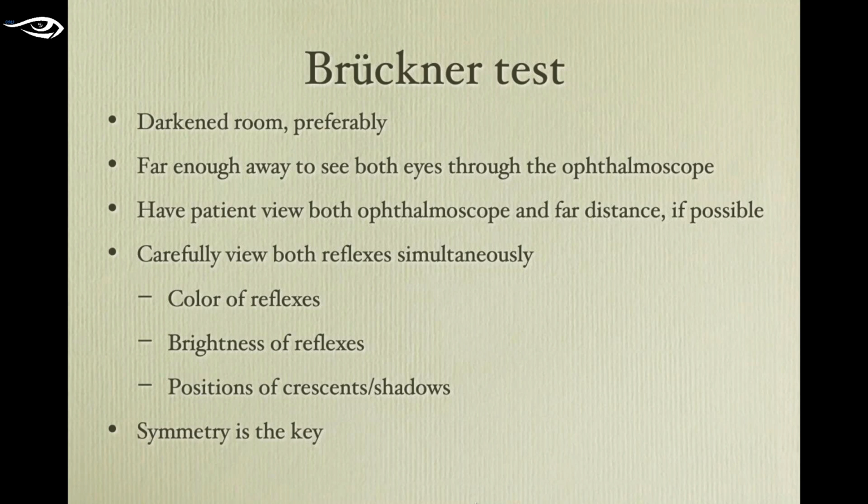When you make the pupil smaller, you decrease the amount of light reflecting off of the retinas. By decreasing the amount of light reflecting off the retinas, you are effectively decreasing the contrast and the total amount of illumination. You're decreasing what you are able to view. When you have big pupils, you have much more light reflecting off the retinas.